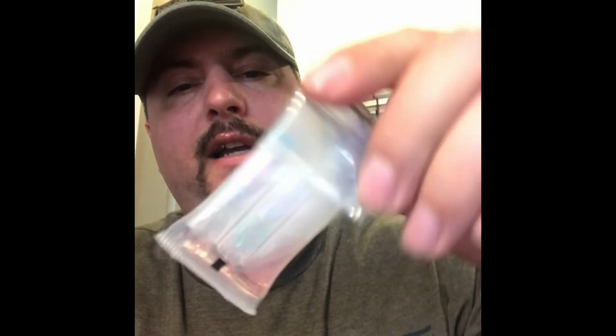It's still pinkish. Again, nothing's in it. Can't charge anybody with no substance. But kind of like, oh, really? That doesn't seem right.